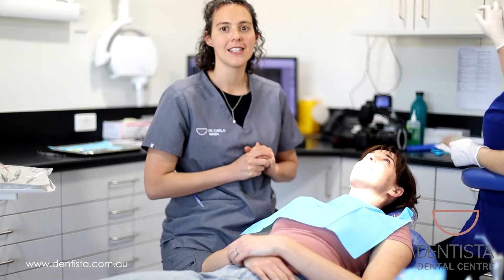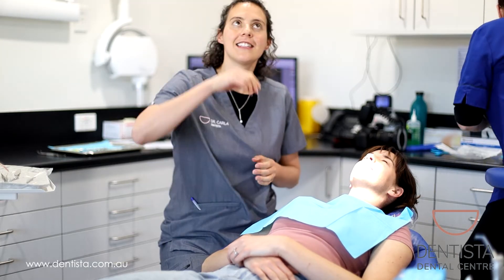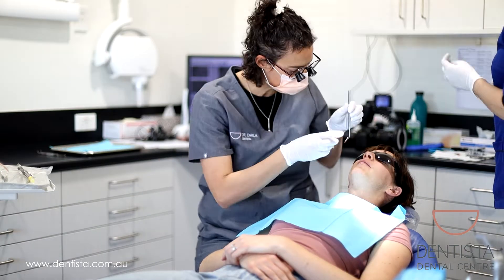So what we're going to do first is put some numbing cream on Erin's gum. This numbing cream tastes like bubble gum, so lucky Erin. Now we're going to put the numbing cream on. Here we go.